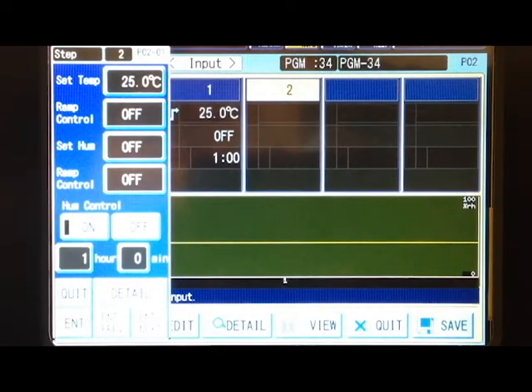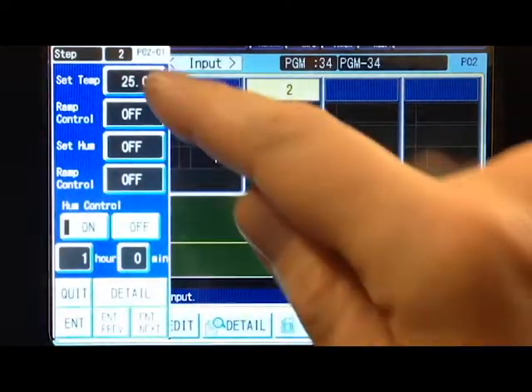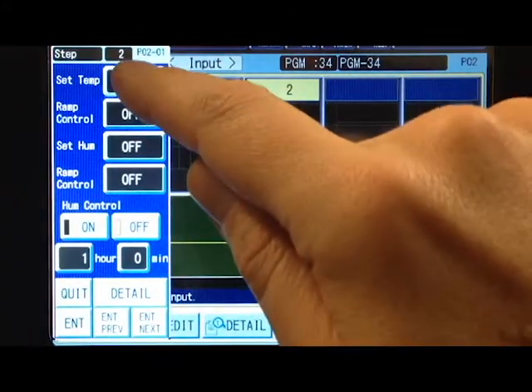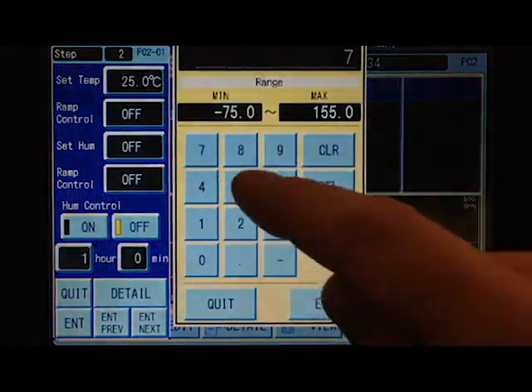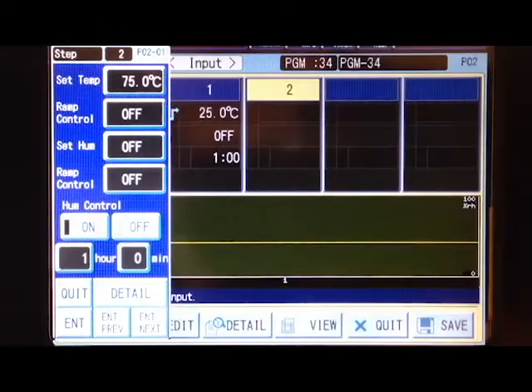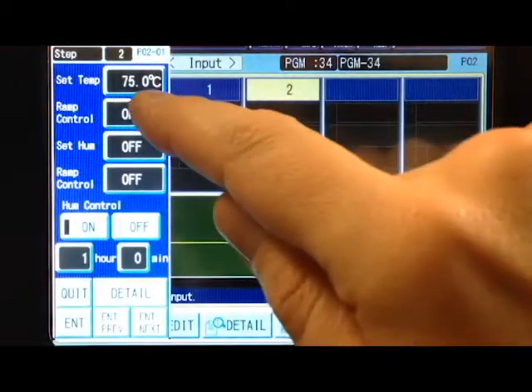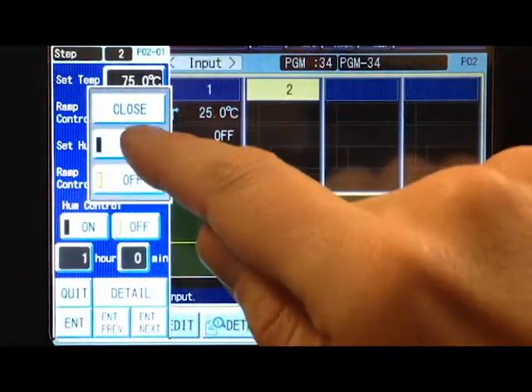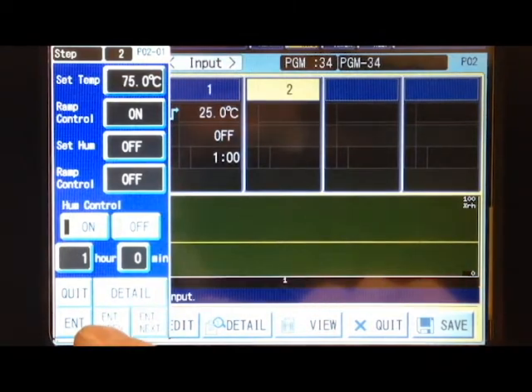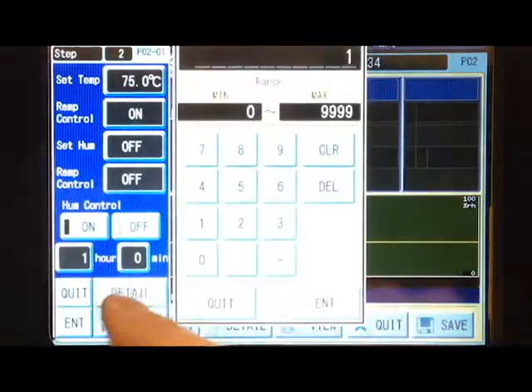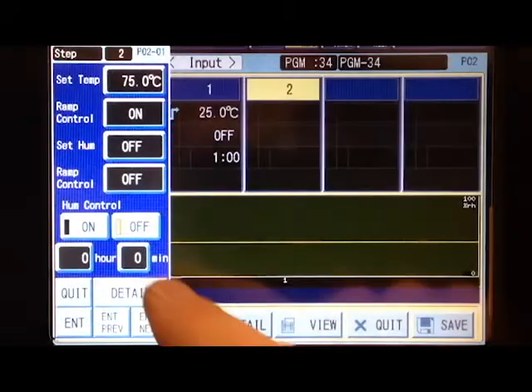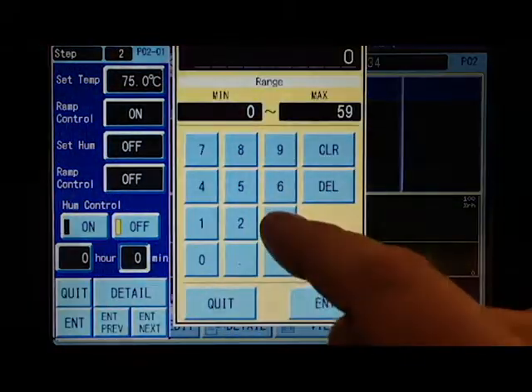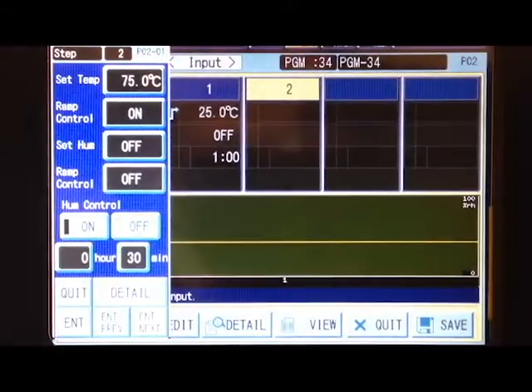Start the next step. You can see step one, but step two already carries the same settings. We're going to change that to 75 and control the ramp, having it ramp for 30 minutes, then next step.